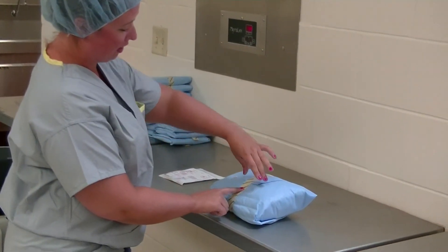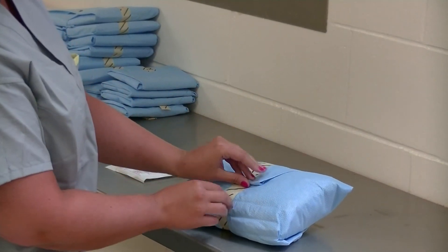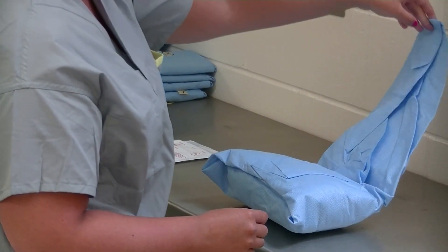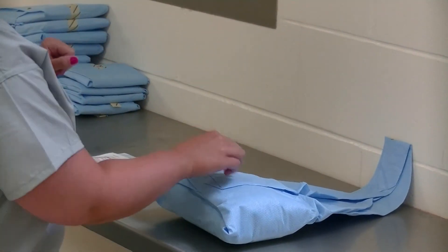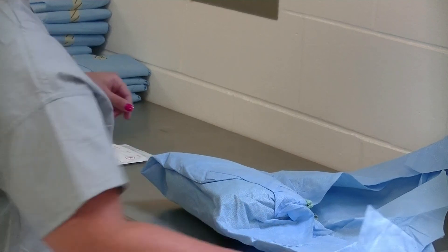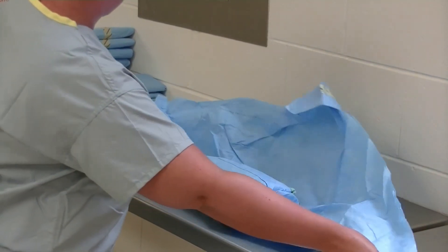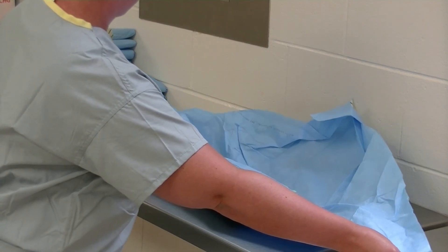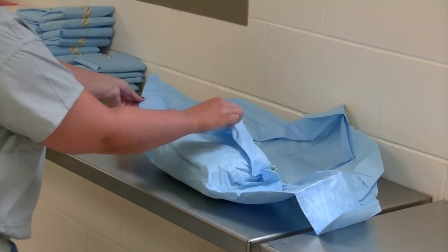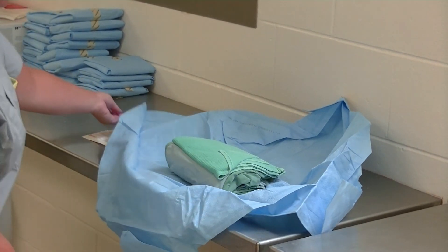We're going to open our gown first. Break your tape, and because of how this is wrapped, I'm going to turn my gown pack over so I can open the first flap away from me, the next one to the side, then to the other side, and the last one open towards yourself — trying to fold the corners down so that nothing will refold back on itself.